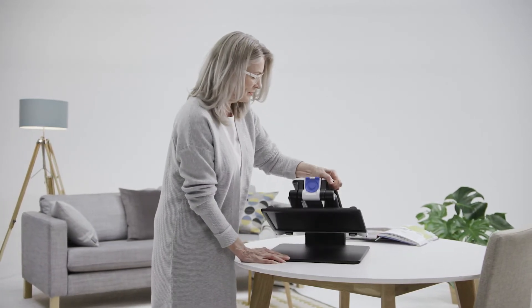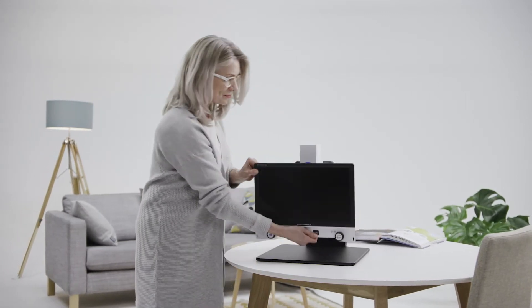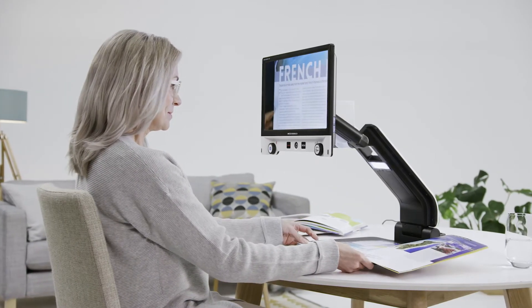The Vario Digital FHD can be quickly and easily unfolded and is then immediately ready to use. Whatever you want to view, the Full HD camera with quick autofocus provides a pin-sharp image.